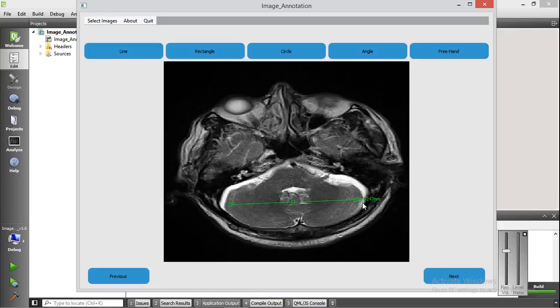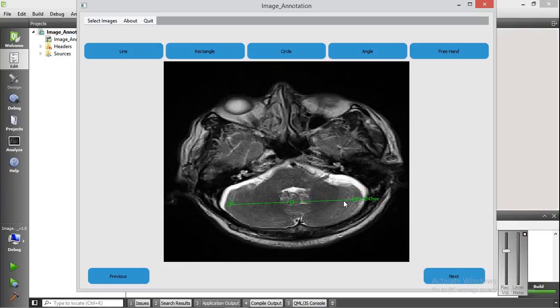This will calculate the length of the line. You can also move this annotation and resize it. As you can see here, the length of the line changes as you resize.